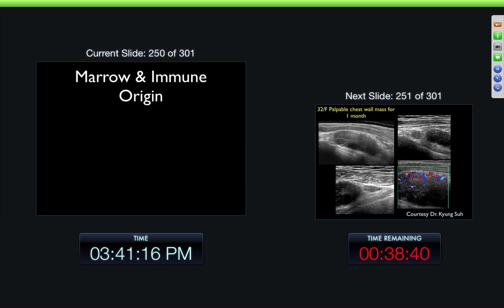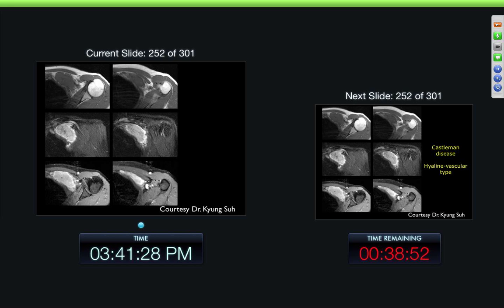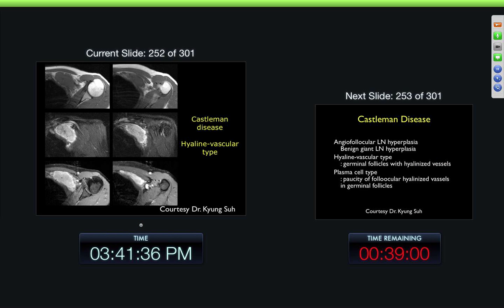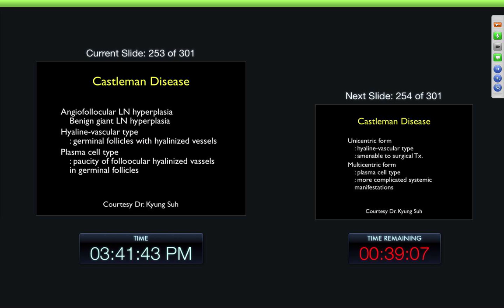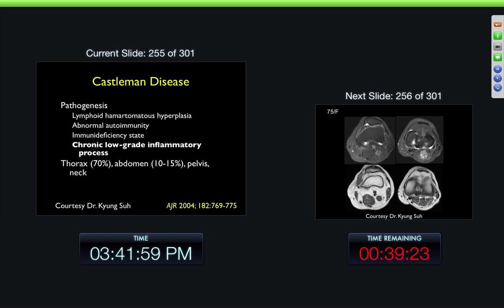Getting to one of the later categories — marrow and immune origin diseases — 32-year-old female with palpable chest wall mass for one month. You can see the mass on ultrasound with some vascularity into it. Here we can see the lesion on MR examination. And this is Castleman's disease, which is lymphoid hyperplasia. There are a number of different types, but you can get just large lymph nodes throughout the body. Some people believe it's a low-grade inflammatory process, or at least some sort of abnormal lymphoid reaction to something.